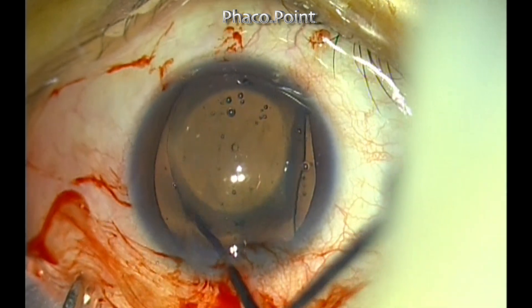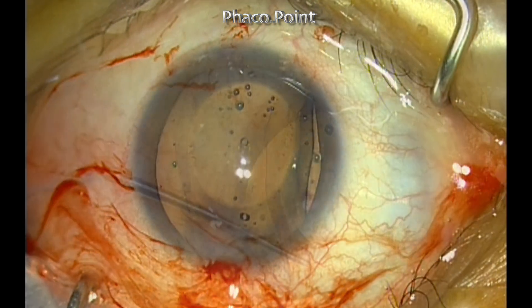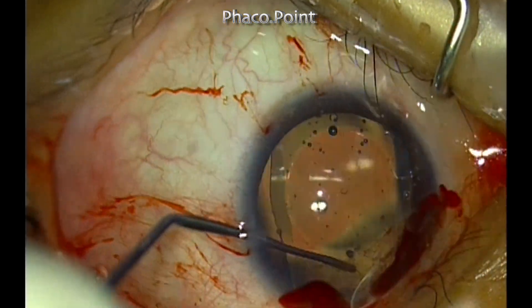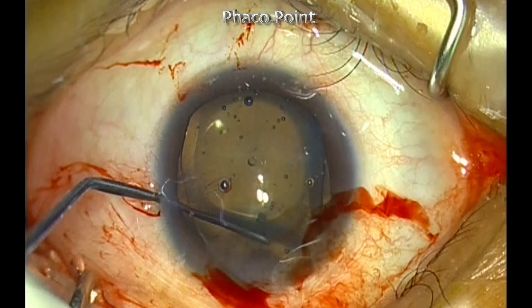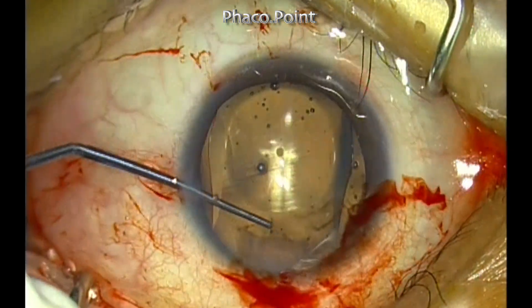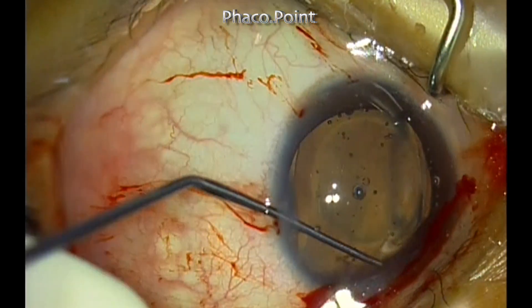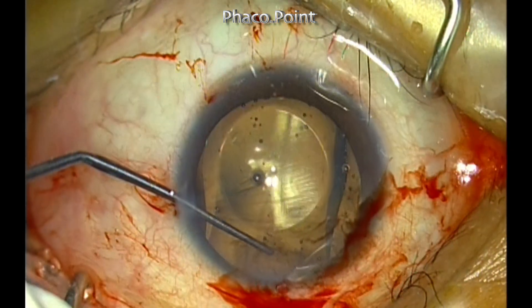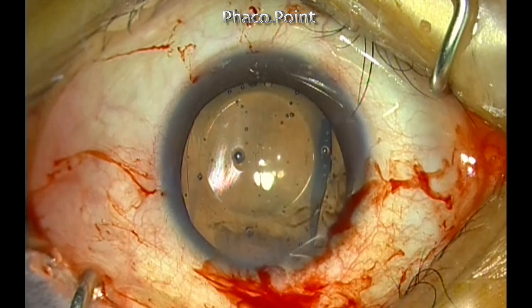This ICL does not need a peripheral iridotomy because of the perforation it already has, and therefore the EVO ICL is a very good option for those who don't like to perform a PI.